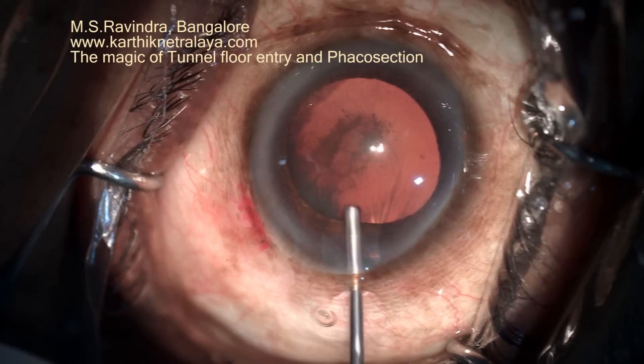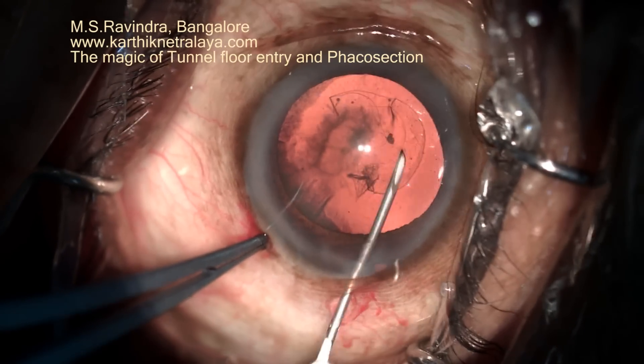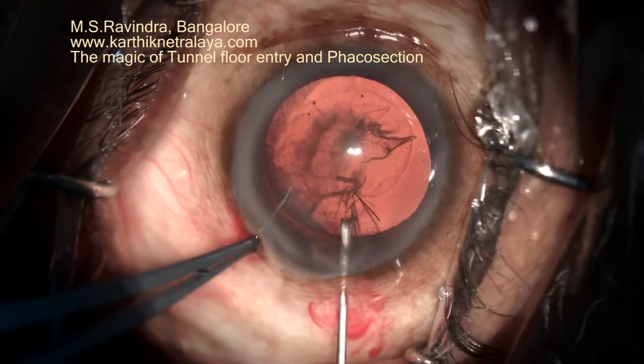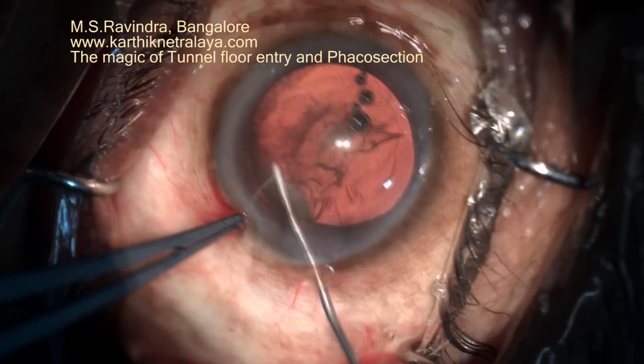This is an eye with a very shallow chamber. You have seen the peripheral iridectomy. The tunnel floor entry technique is of great use whenever the chamber is shallow or when the cataract is mature. The chamber is rock steady and deeply formed with the HPMC.